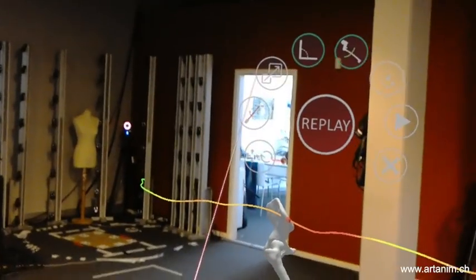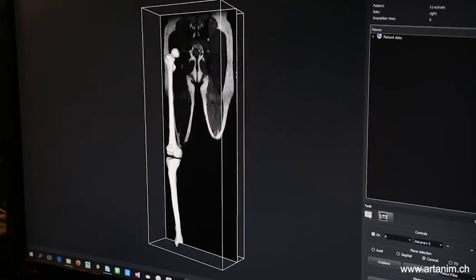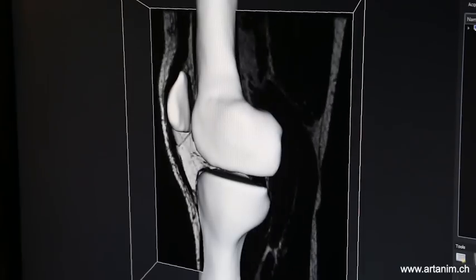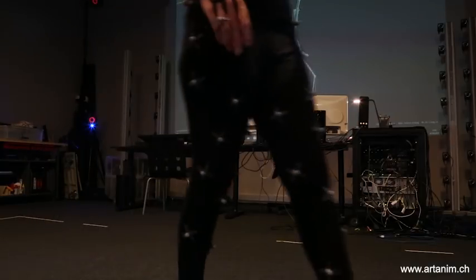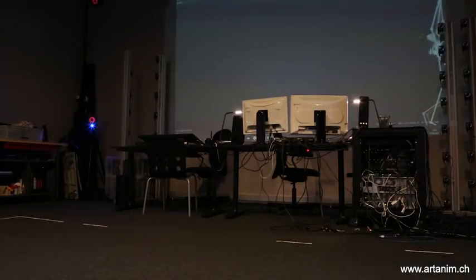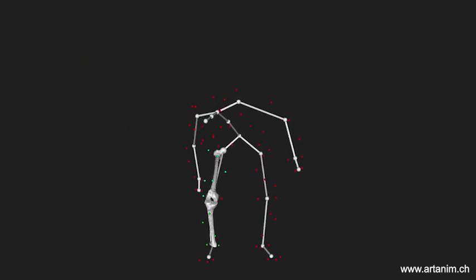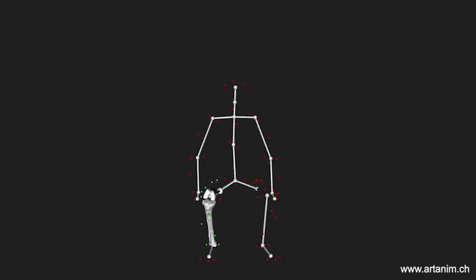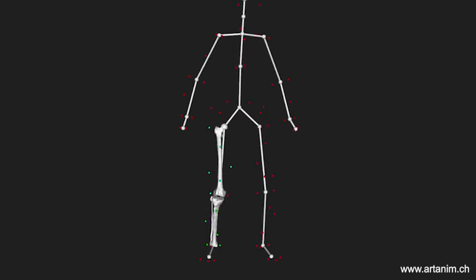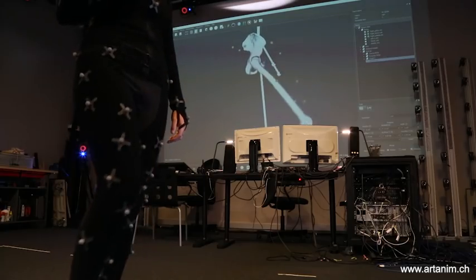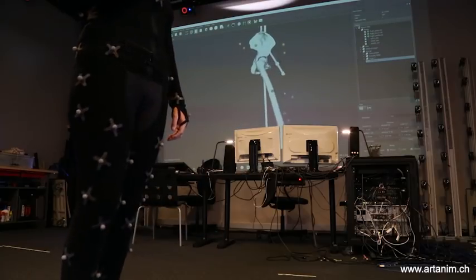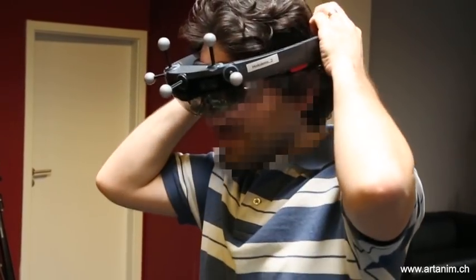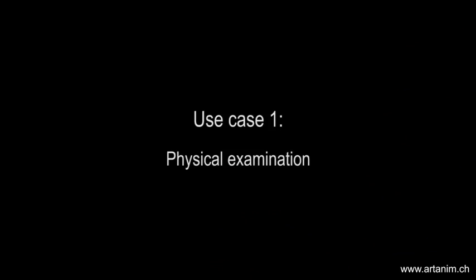Our application is built upon our previous work on joint biomechanical modeling. The bones of the subject are reconstructed in 3D from medical images. Then, markers placed on the subject are recorded by an optical motion capture system and streamed to a biomechanical simulation software that computes in real time the joint kinematics from the markers' trajectories. The computed bone poses are finally streamed to HoloLens, which was previously registered with the motion tracking system.